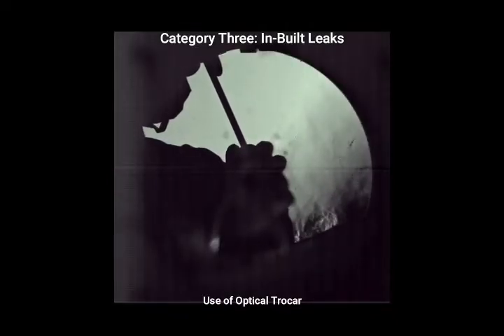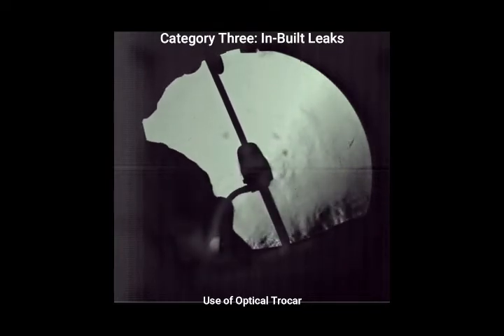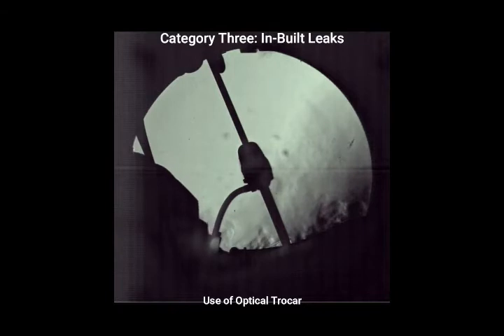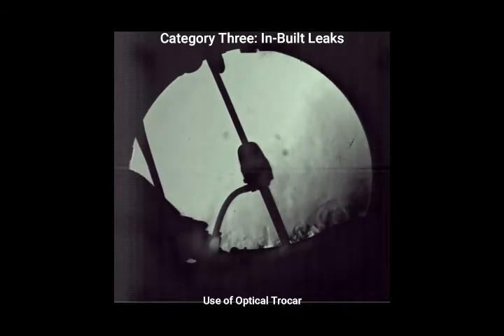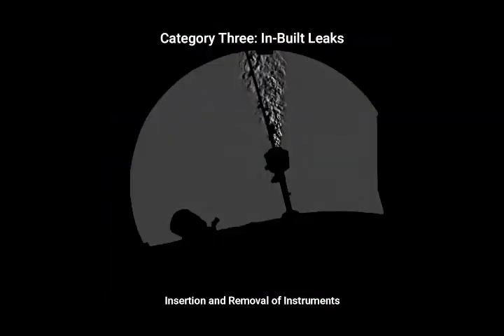Optical ports, of course, by their mechanism of action, induce a lot of gas flow during their placement. Of course, if the gas has not been inside the patient, it can't confer pathogenic risk. Gas can also leak during insertion and removal of instruments into and out of trocars.